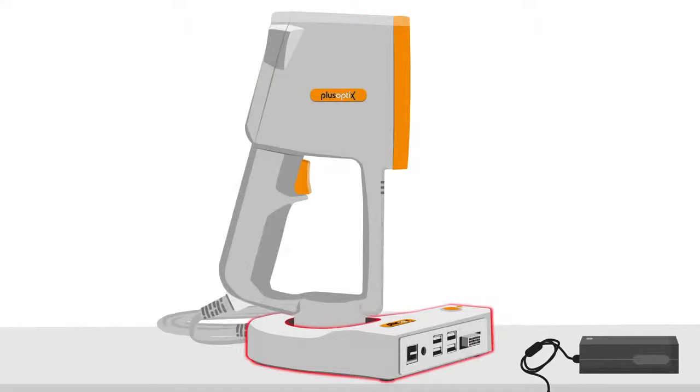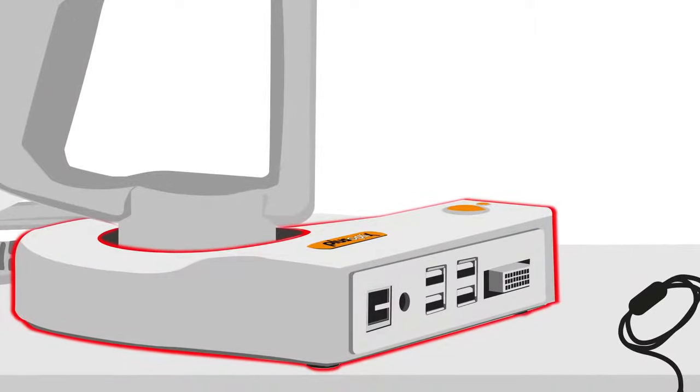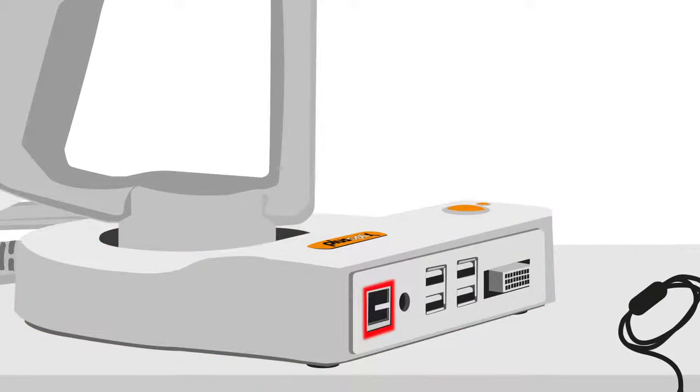Now, let's look at the cradle. Starting on the left, there is an RJ45 connector for the connection to your electronic medical record. Next is the 12V power supply connection.